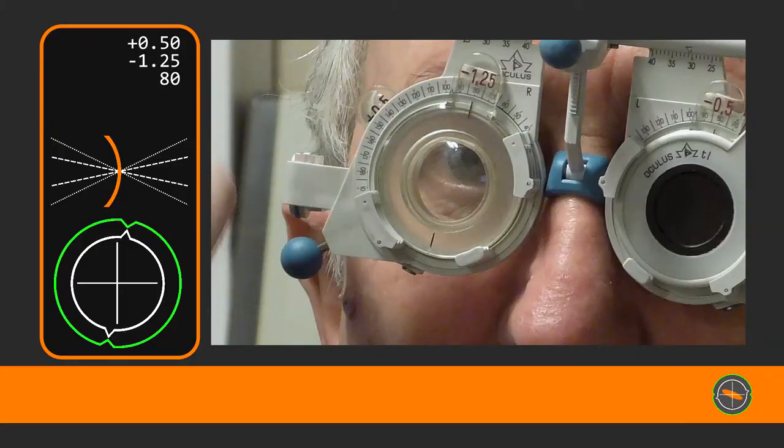Let's set the scene. This is an elderly gentleman, 75 years old. We are refracting his right eye. We've just finished the axis measurement and are moving on to the power measurement.